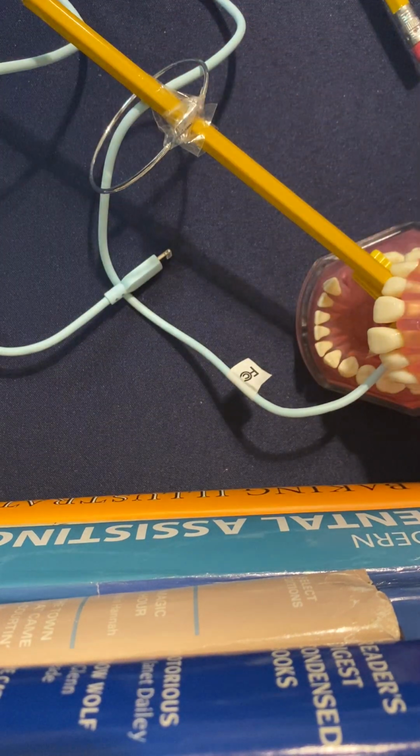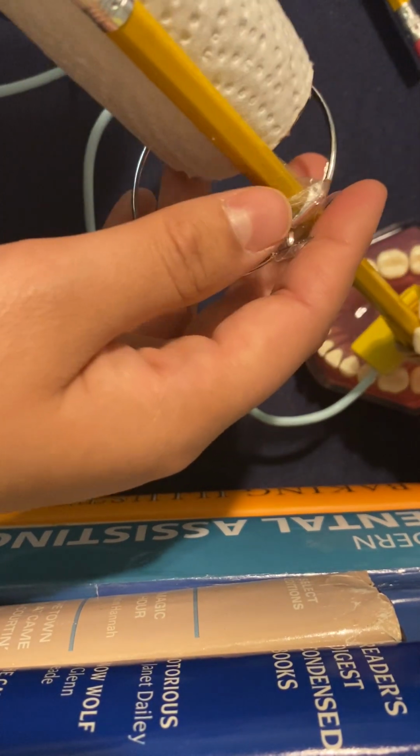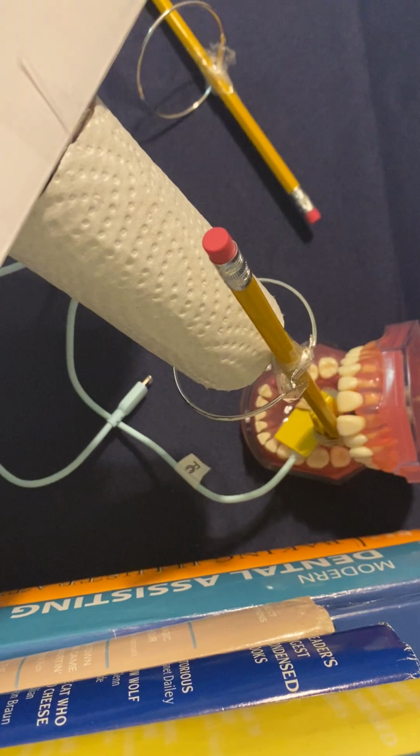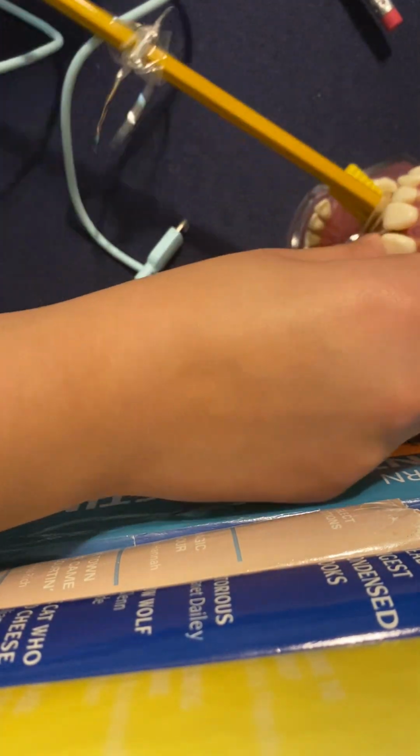And you're going to want to point down from the pupil to the mid mandibular area. There we go. Much like so, if I can get it to pick up. It's very, very hazy. All right.